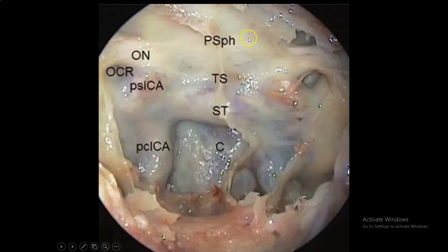Again, planum sphenoidale, chiasmatic prominence, tuberculum sulcus, floor of the sella, clivus, paraclival or lateral carotid, internal carotid artery inside the sinus. This is the right optic nerve, the left optic nerve, and there is a recess between the carotid and the optic nerve, which is the lateral optico-carotid recess, and it is in the cavity of the anterior clinoid. And this is the medial optico-carotid recess in the cavity of the middle clinoid. And the carotid here is passing lateral to the upper third of the clivus, passing in the cavernous sinus, then coming out medial to the optico-carotid recess, forming the clinoidal carotid artery, having two rings, as we'll see.